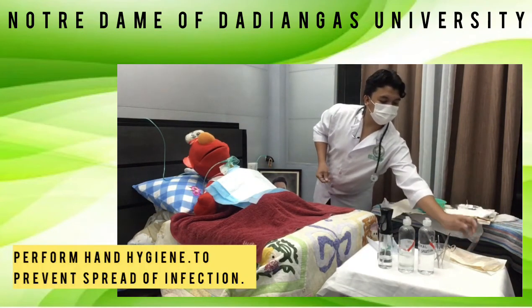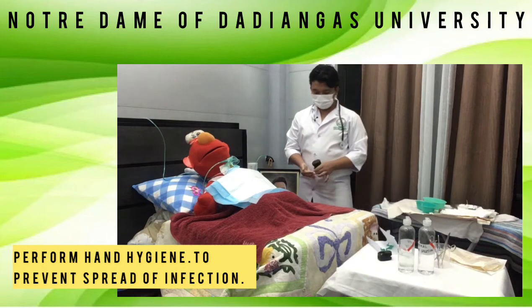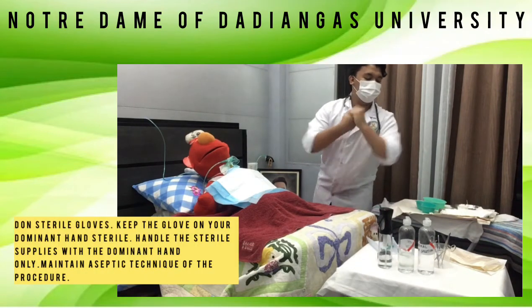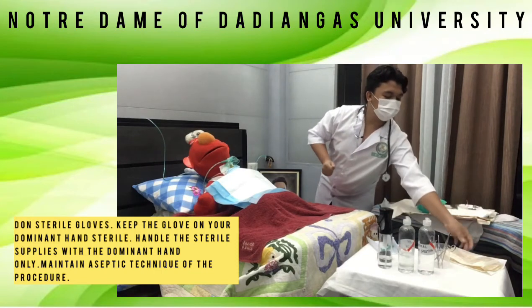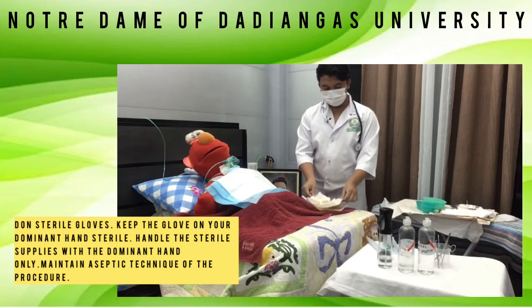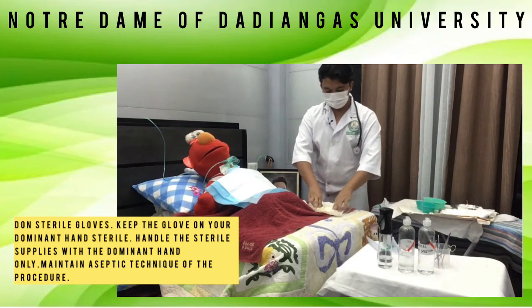Perform hand hygiene to prevent spread of infection. Don sterile gloves. Keep the glove on your dominant hand sterile. Handle the sterile supplies with the dominant hand only. Maintain aseptic technique during the procedure.